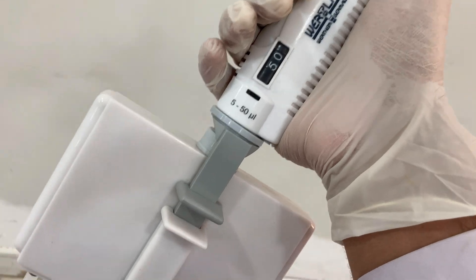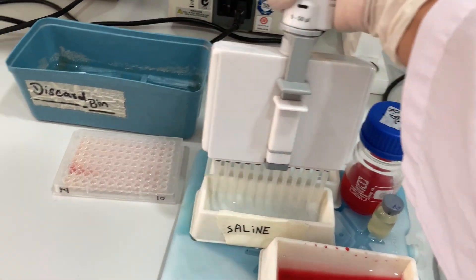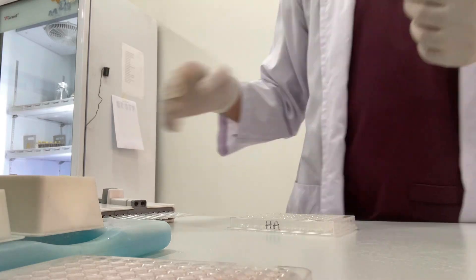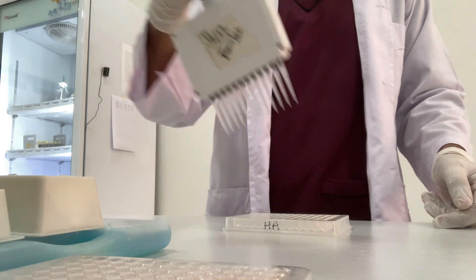After doing the HA, we are now moving further toward the HI, which is hemagglutination inhibition. For that, you have to take 50 µl of normal saline. Remember that in the HI, we fill the saline up to 96 wells of the titer plate.